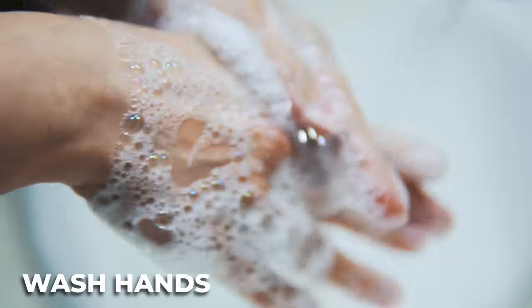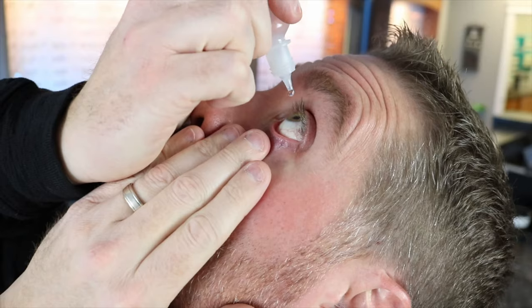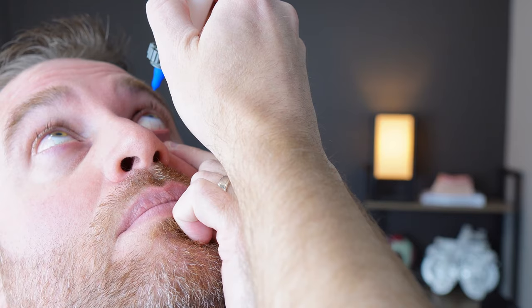Before we get started, wash your hands and take a deep breath. I know this can be very frustrating and nerve-wracking, but don't worry, we're going to get this. If you have any artificial tears, put one or two drops in there. When the contact is dry, it's really tricky to get out, and that will help glide the contact or help it move a little bit better.